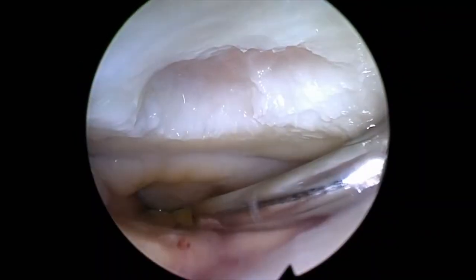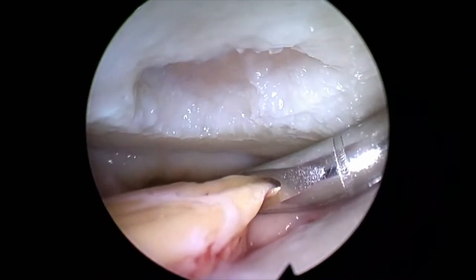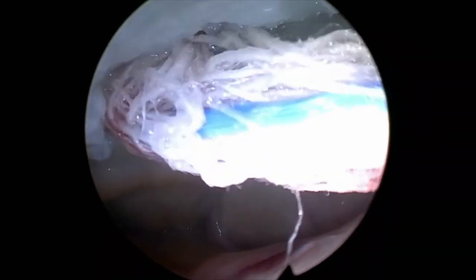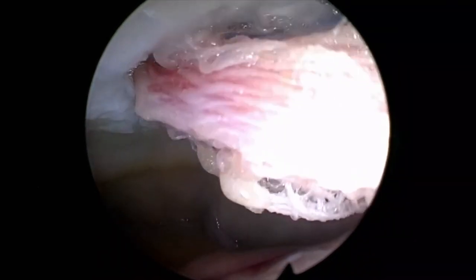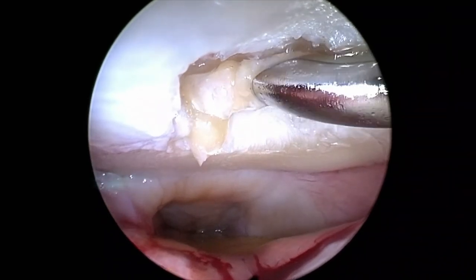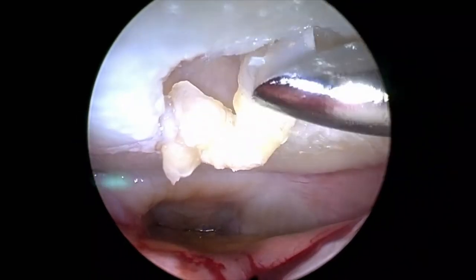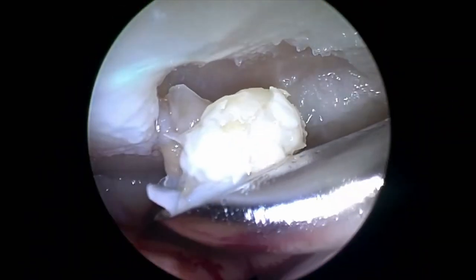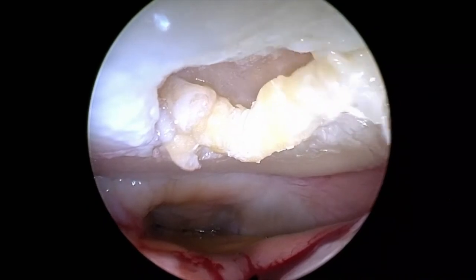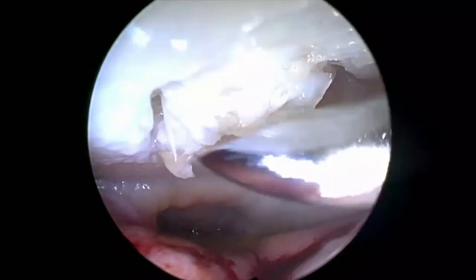When you are done with the debridement, you need to remove the fluid from the joint — the easiest way is to use the shaver. If you notice bleeding from the synovium, you can stop it with the high-frequency electrode, then use a swab or compress to continue drying. The defect does not have to be completely dry, as the cells you are transplanting — whether ACI or minced cartilage — are surrounded by some fluid. Then start implanting the cells by inserting the applicator. For defects of the patella or medial or lateral femoral condyle, it is advantageous that the applicator is curved, allowing you to fit the cartilage easily. Since the cells are preloaded with PRP which has adhesive properties, the material adheres to the defect without falling out. You can use the applicator itself or a probe to make final adjustments.